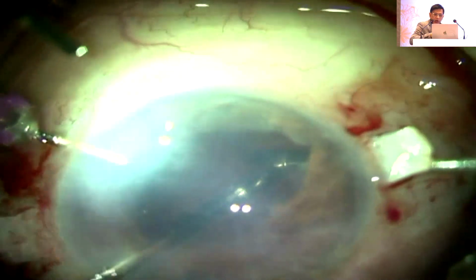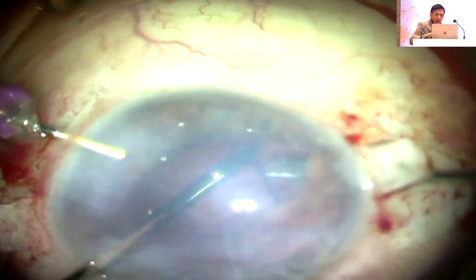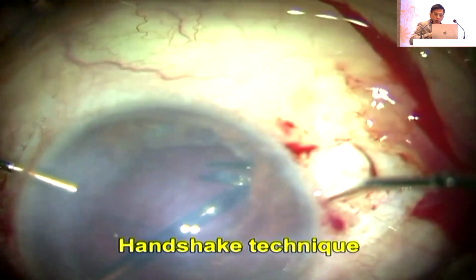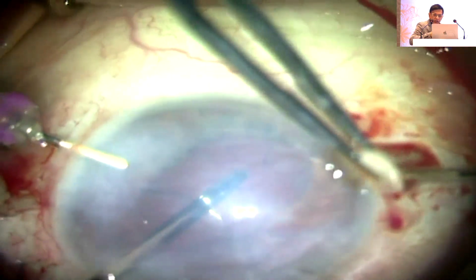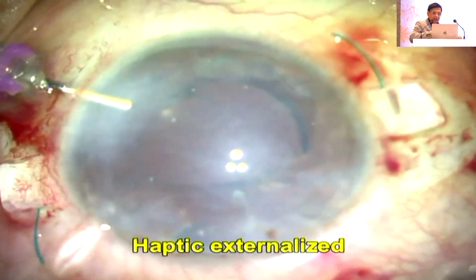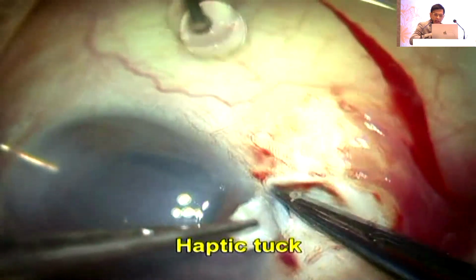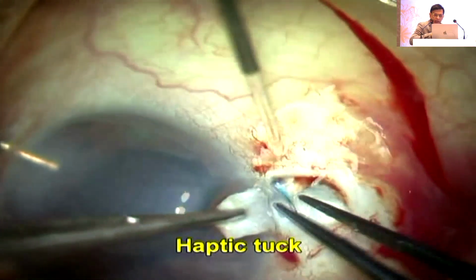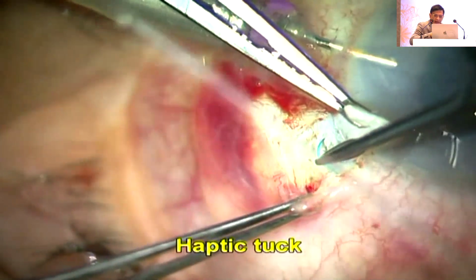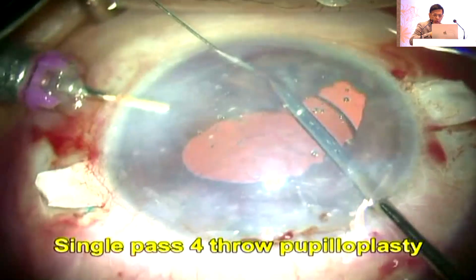Doesn't matter where. All you do is transfer the haptic from one hand to the other so that you can now catch the tip of the haptic. Once that is caught, externalize. So far, so good. Once that's done, my next step is to tuck these haptics inside. So I take a 26 gauge needle, tuck this into the Charlie's pocket. Once it's there, this great system by Gabor Scharioth from Germany, tuck it into the pocket.